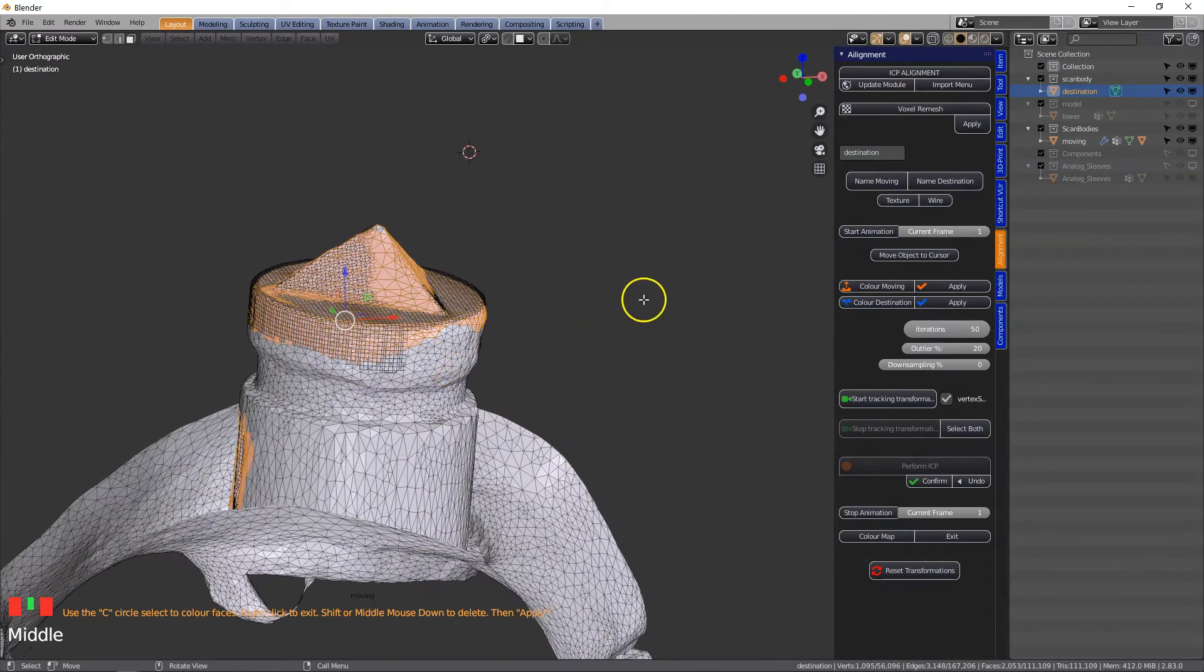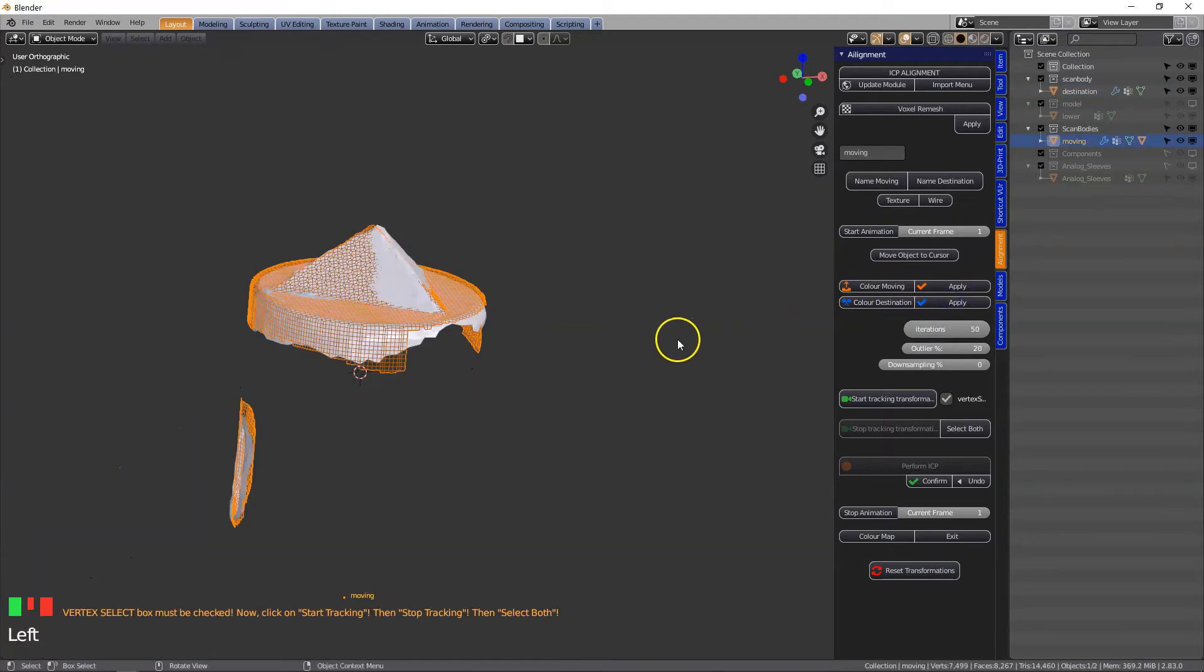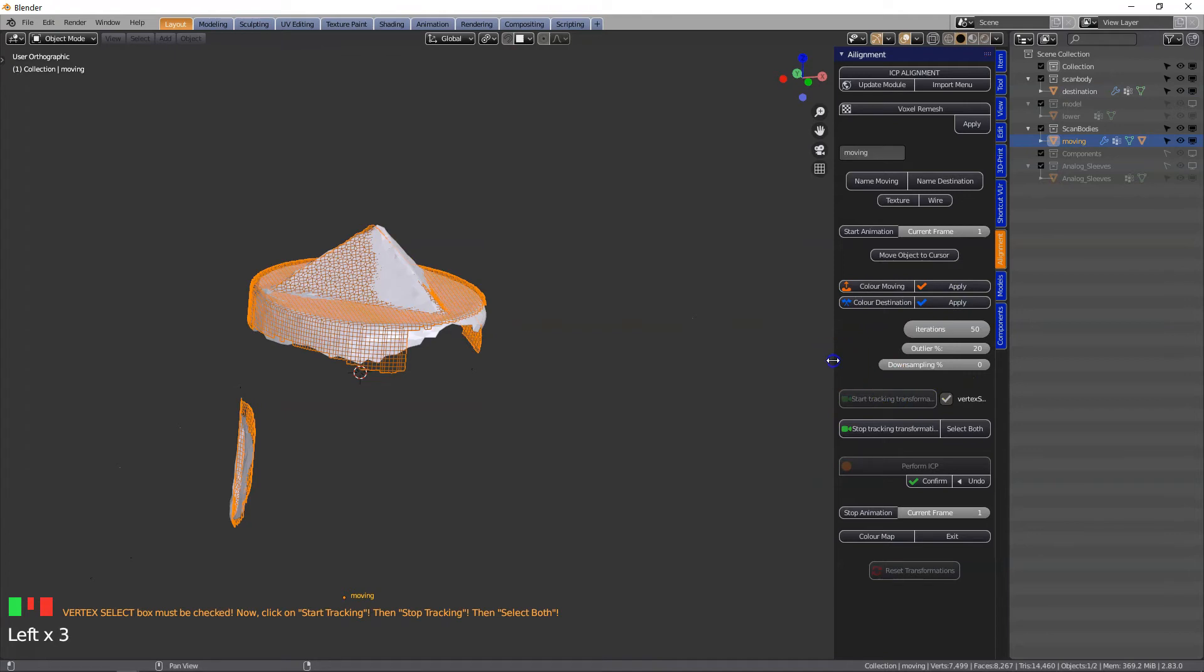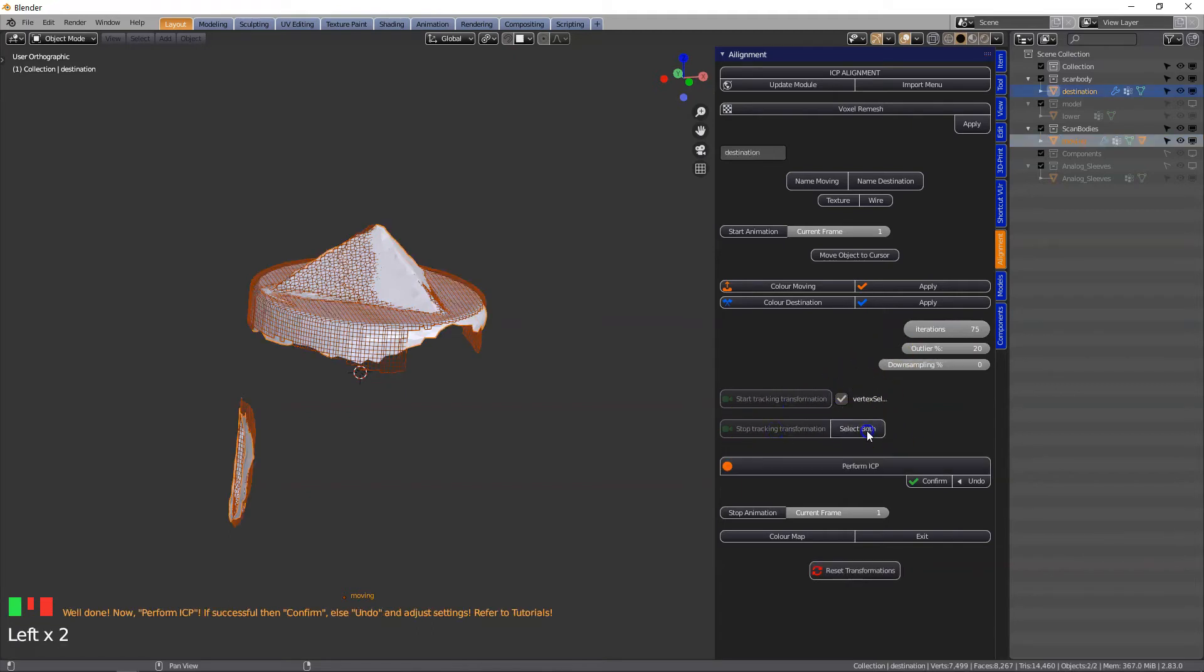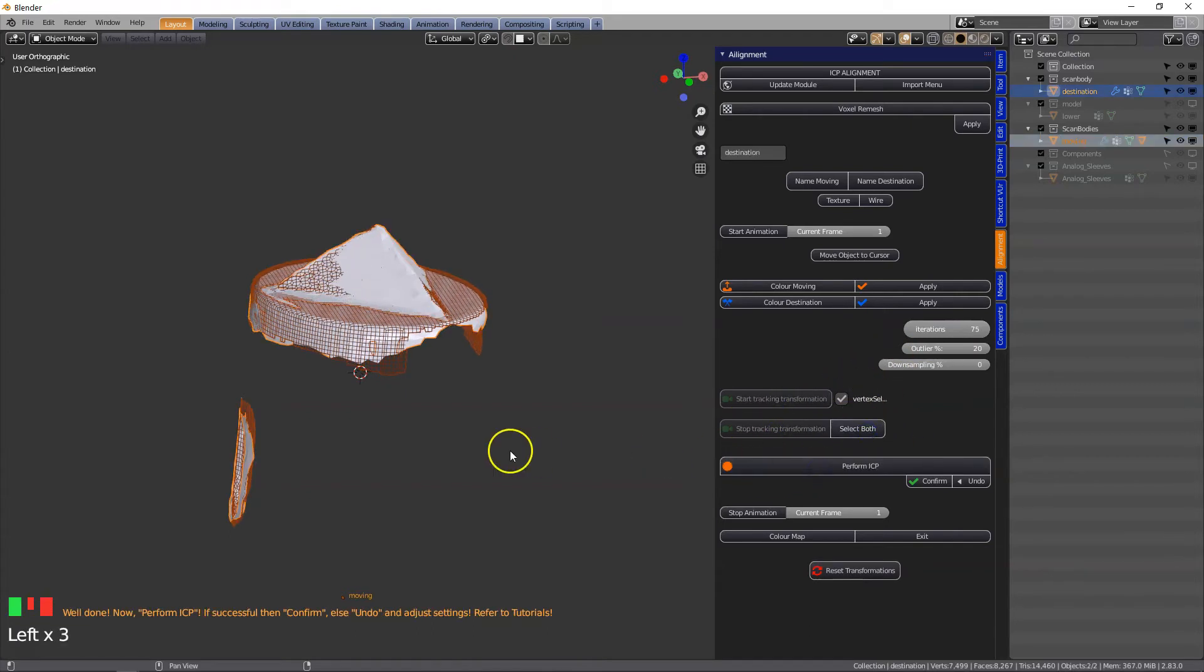Then we're going to click on apply and we're going to start tracking. Make sure the vertex select button is checked. We could actually set this to 75, stop tracking, select both, perform ICP.